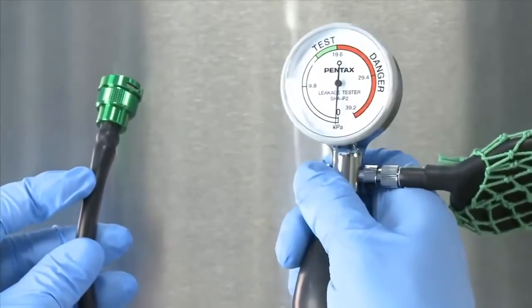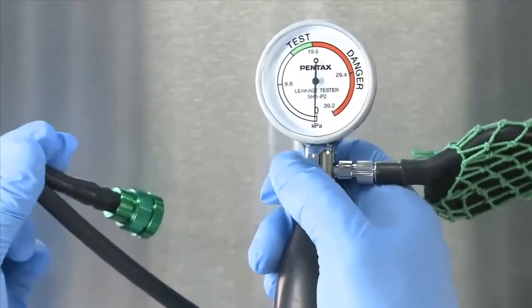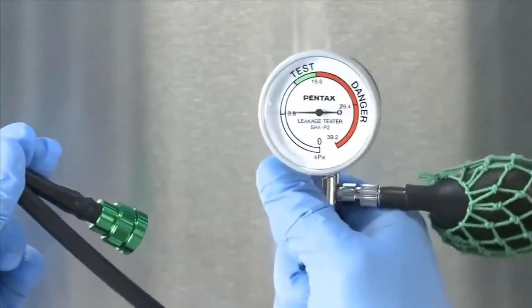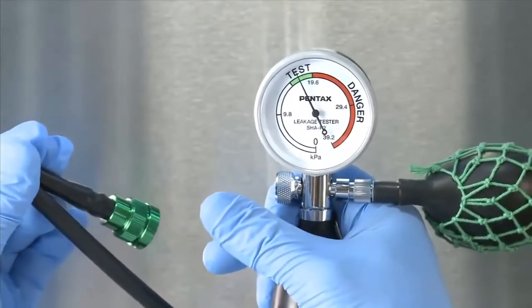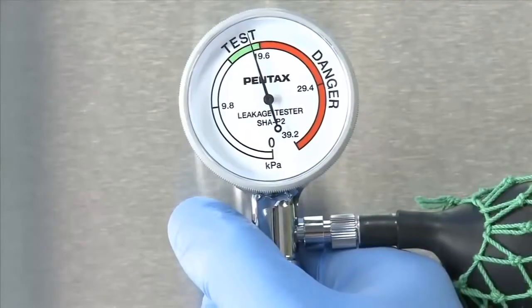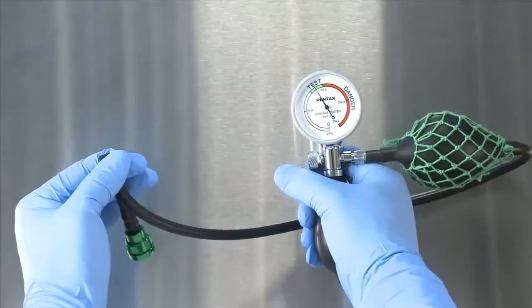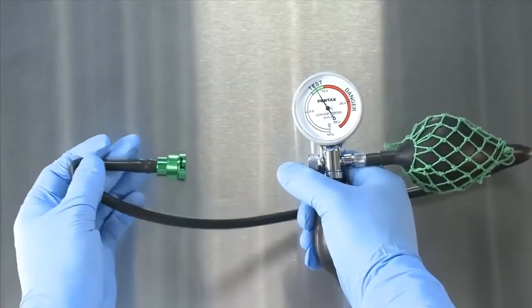Close the pressure relief valve, pinch the tubing and pump the tester into the green zone. If the tube is fully occluded, the leak tester will hold the pressure and the needle will not move. When the tubing is released from a pinched position, the gauge needle should drop.